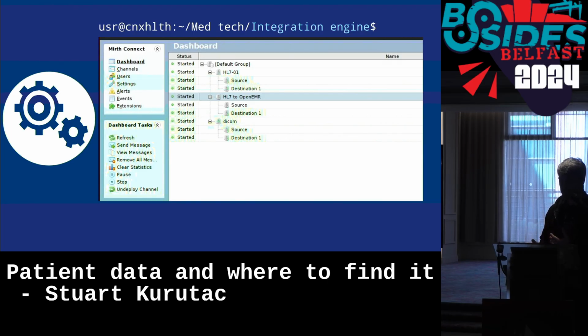There's a Java client that you need to interact with it with all its full capabilities. It does have a web interface, but there's very few functions that you can do on that. So if you logged in to one of these, the default configuration doesn't have multi-factor authentication or anything like that. There is facility to do that with it though. And I've seen these in networks where it's just admin. So, these are things you need to look for.